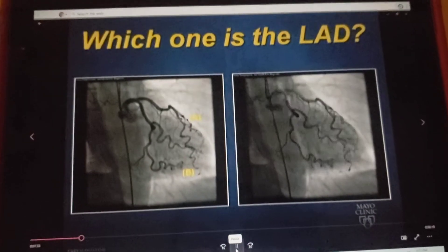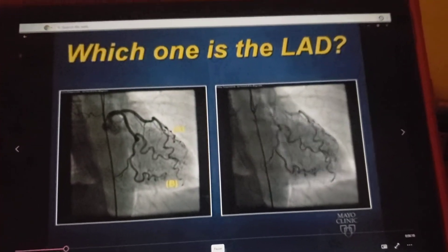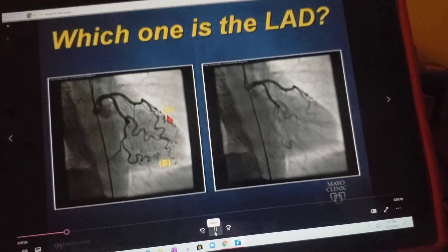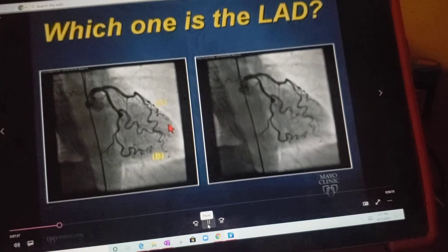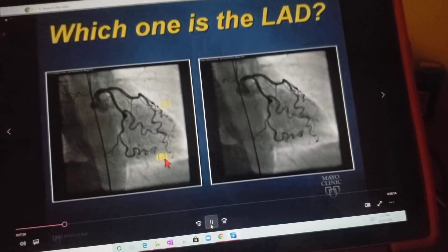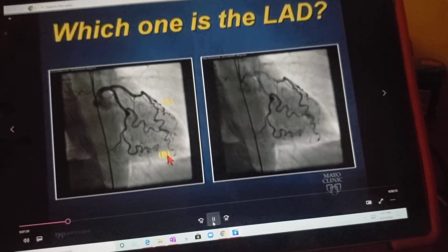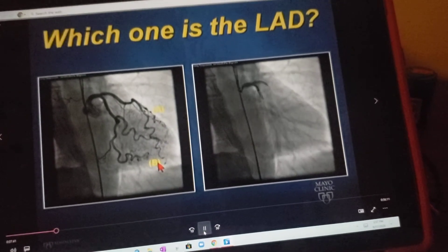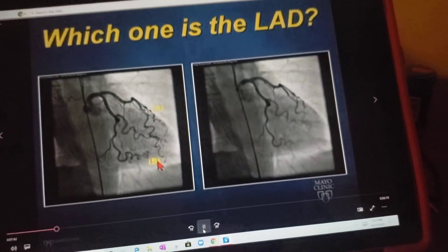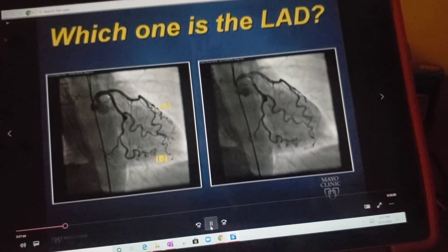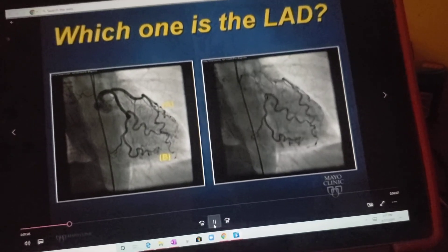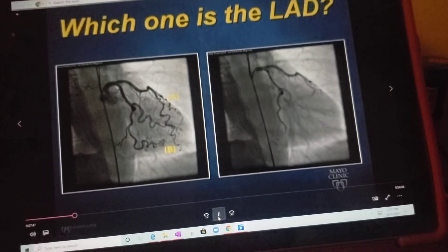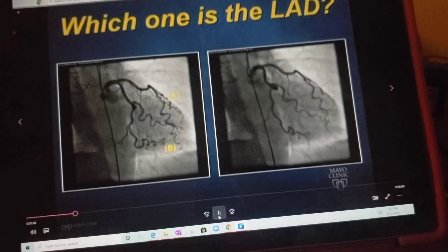Which one of these is the LAD? Is it A, these branches over here, or B? We're not going to use the clickers here in the interest of time. I just want you to think to yourself which one of these is the LAD. If you were to see a lesion, which one would you code?